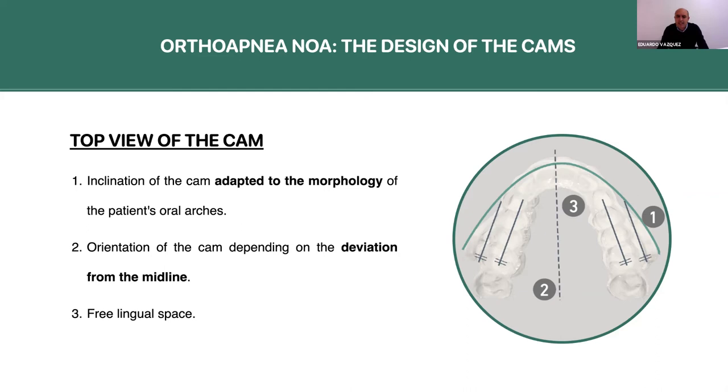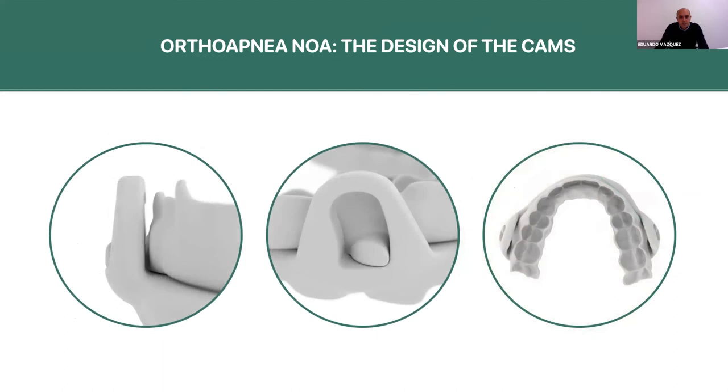Also, since the device is designed with CAD-CAM, we can make a really thin and small device, which obviously increases the patient's comfort. So here you can see some pictures of the NOA, the cam from a front view, from a sagittal view, and from a top view.